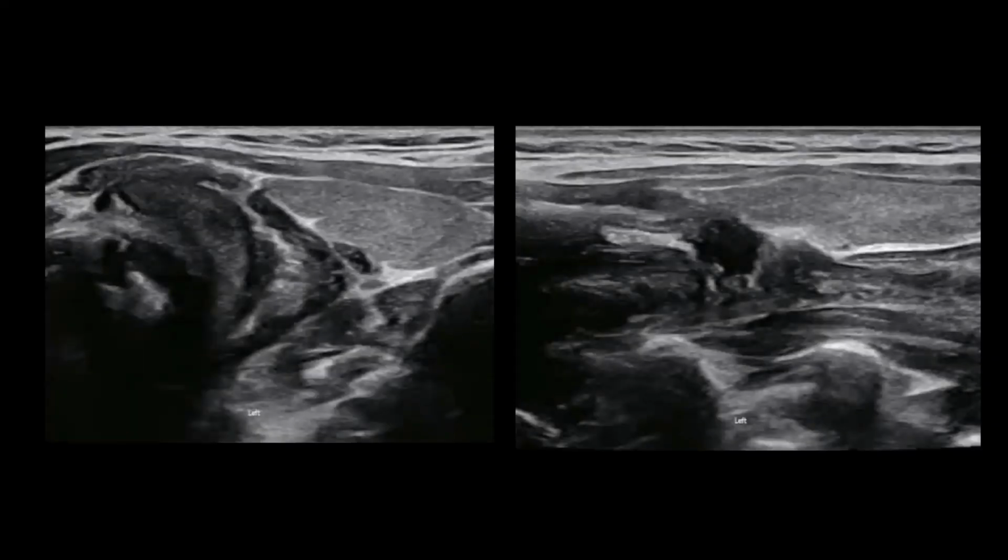In both transverse and longitudinal video clips, the lesion is shown to be connected to the esophagus. This lesion is an esophageal diverticulum.